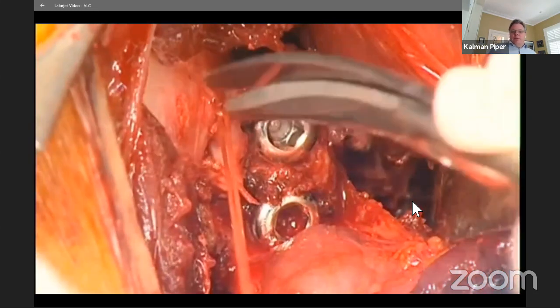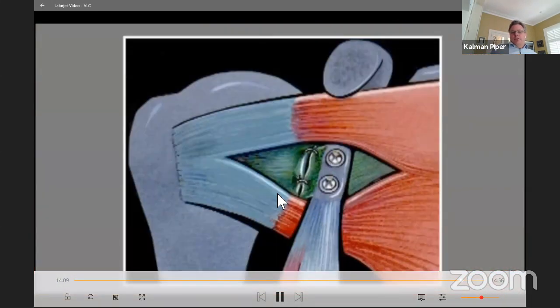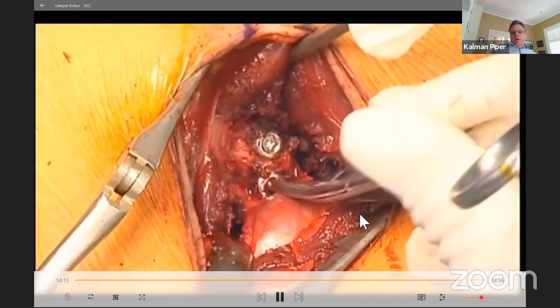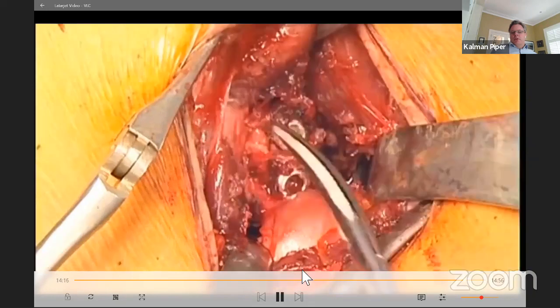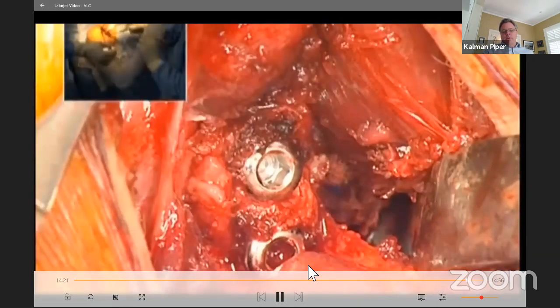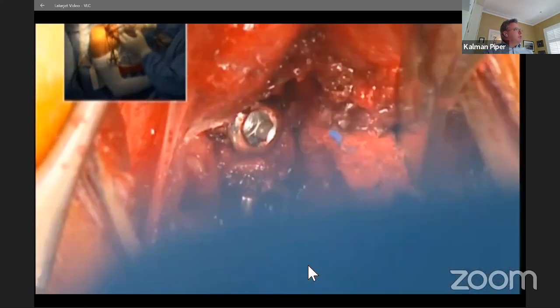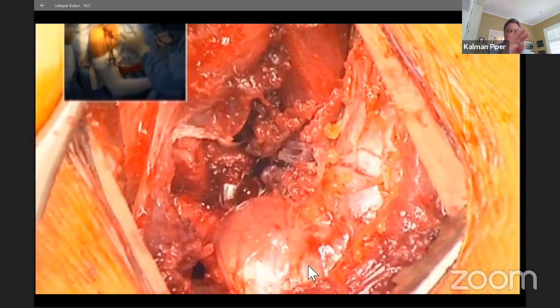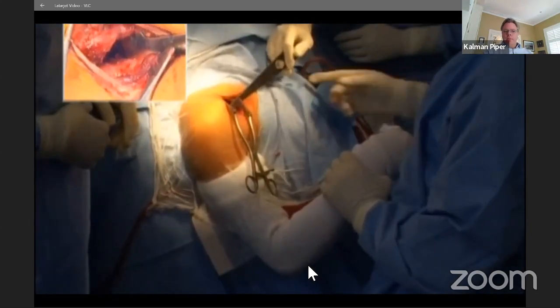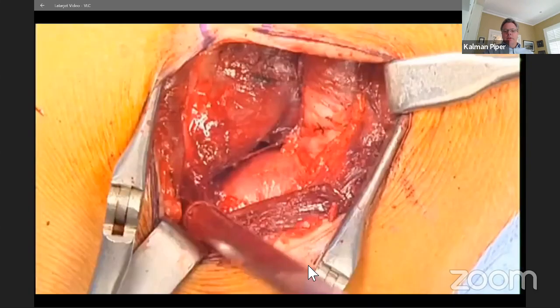So here you can see the two screws from the Latarjet graft, the capsular repair, and then the subscapularis split. So there's a superior subscapularis split still held by the Steinmann pin, and the inferior part of the subscapularis is down here with the conjoint tendon going over the top. Once all the retractors come out, don't forget the rotator cuff, the superior two thirds and the inferior third of the subscapularis will come together a little. And some people suggest closing the subscapularis split.